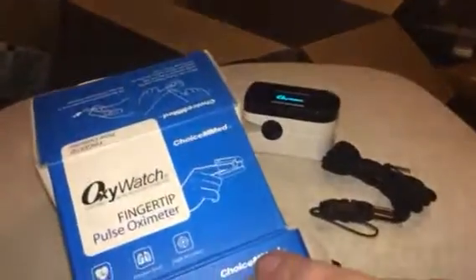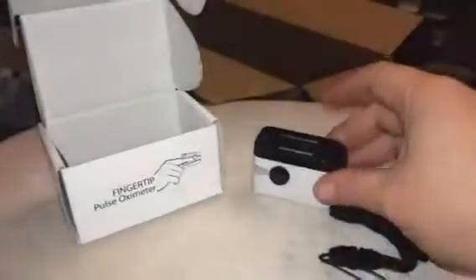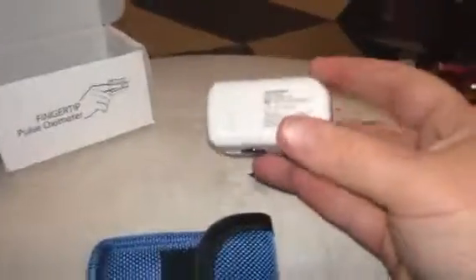Hey everybody, this is Bethany. Today I am reviewing a pulse oximeter from OxyWatch. This is a nice little tool to have at home, especially if you have a kiddo with asthma or anything like that.